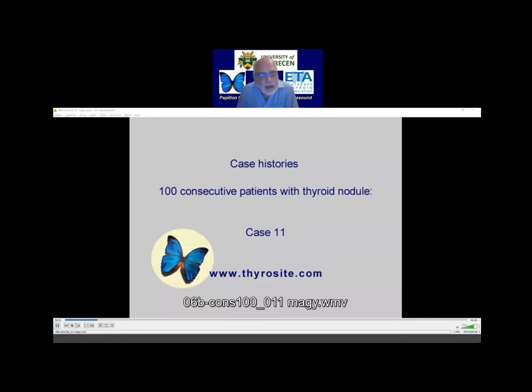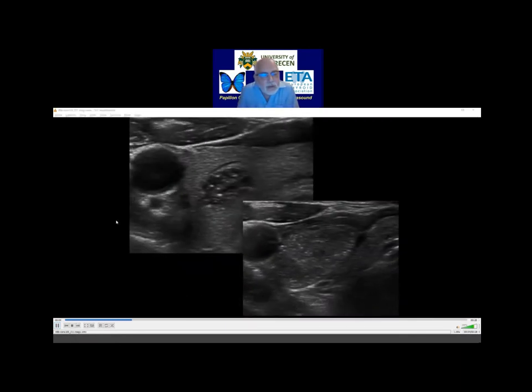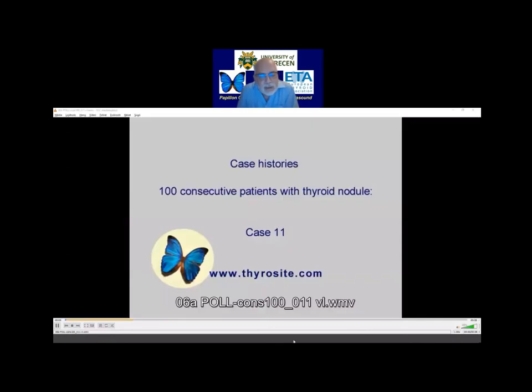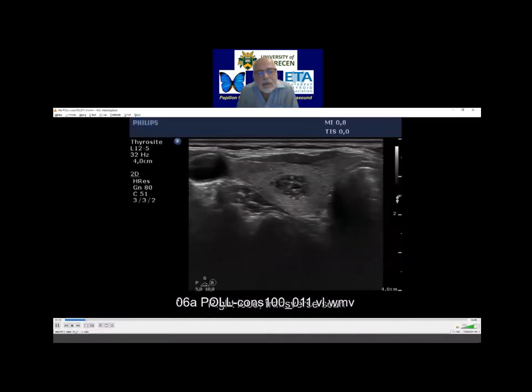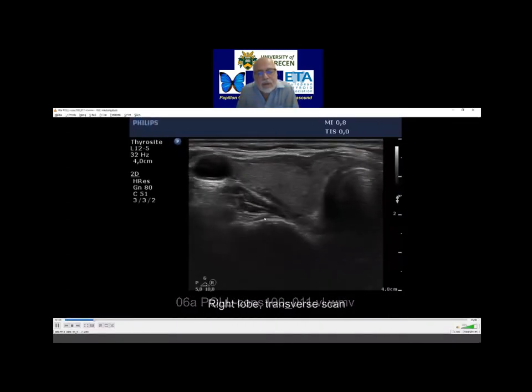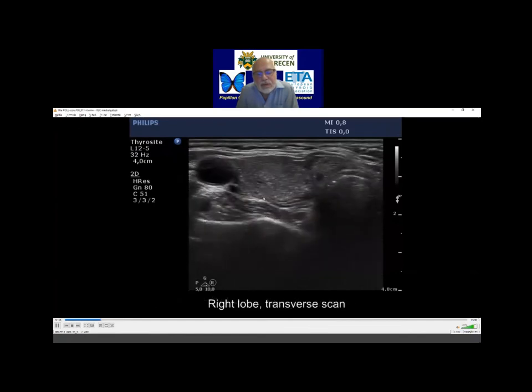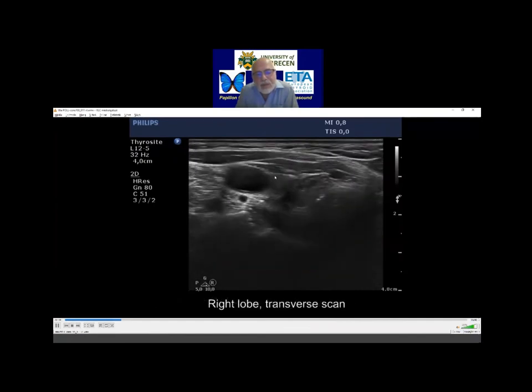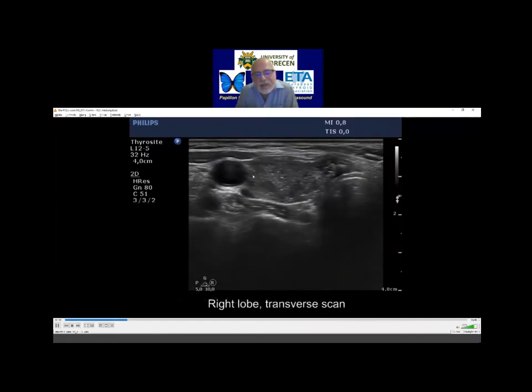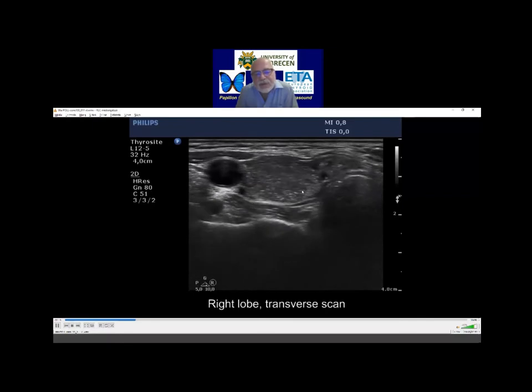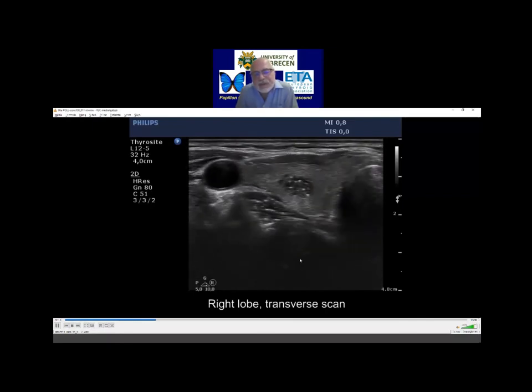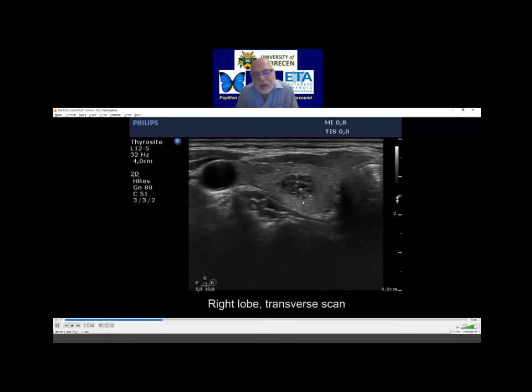I start with the first video without this enlargement. There are many granules in the smaller nodule, but this is an absolutely different pattern. This is very close to the so-called starry sky phenomenon.